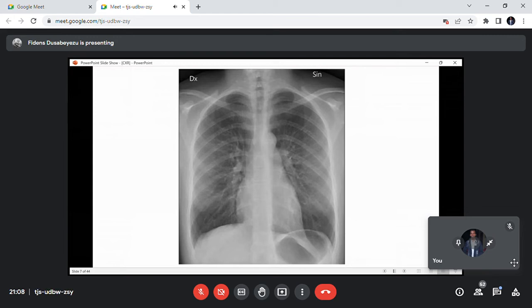Shape. In radiology, whether CT scan, X-ray, ultrasound, MRI, or nuclear, we always use those four S's to describe something. By looking at the mediastinum, I use the components, number one being size.